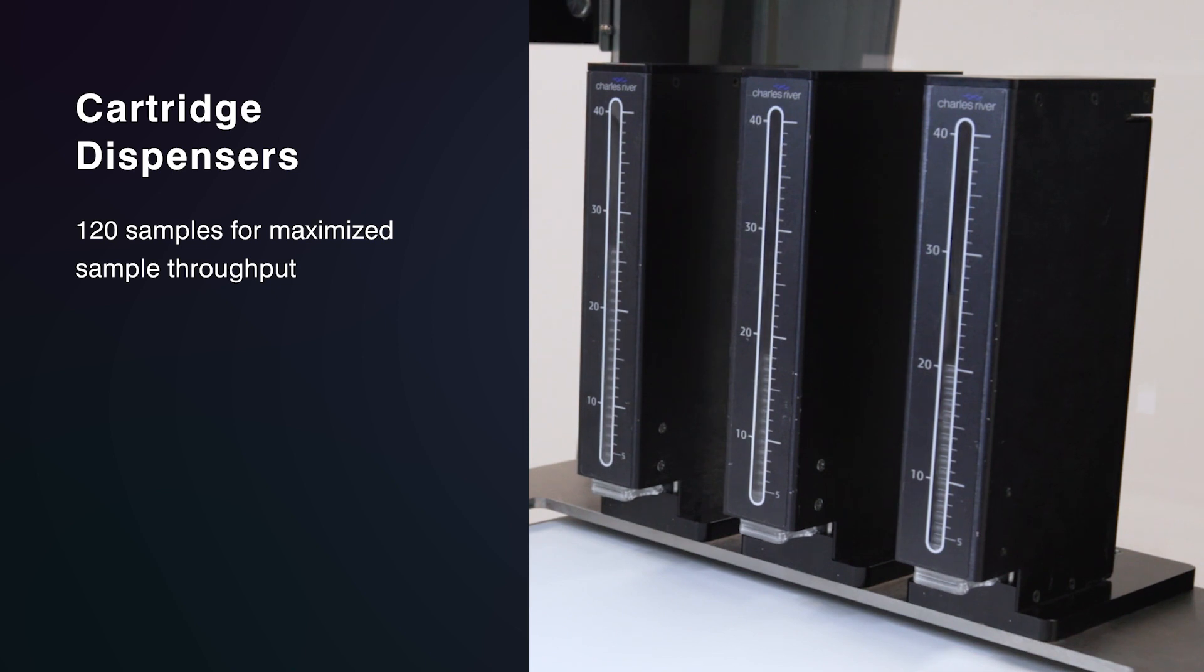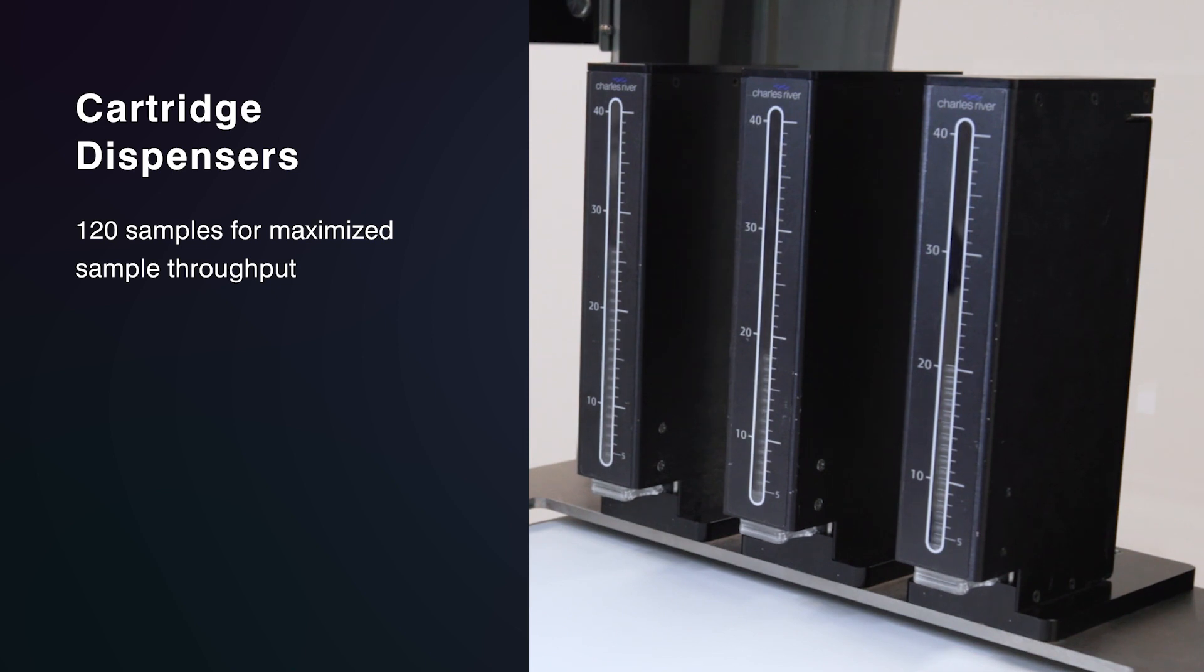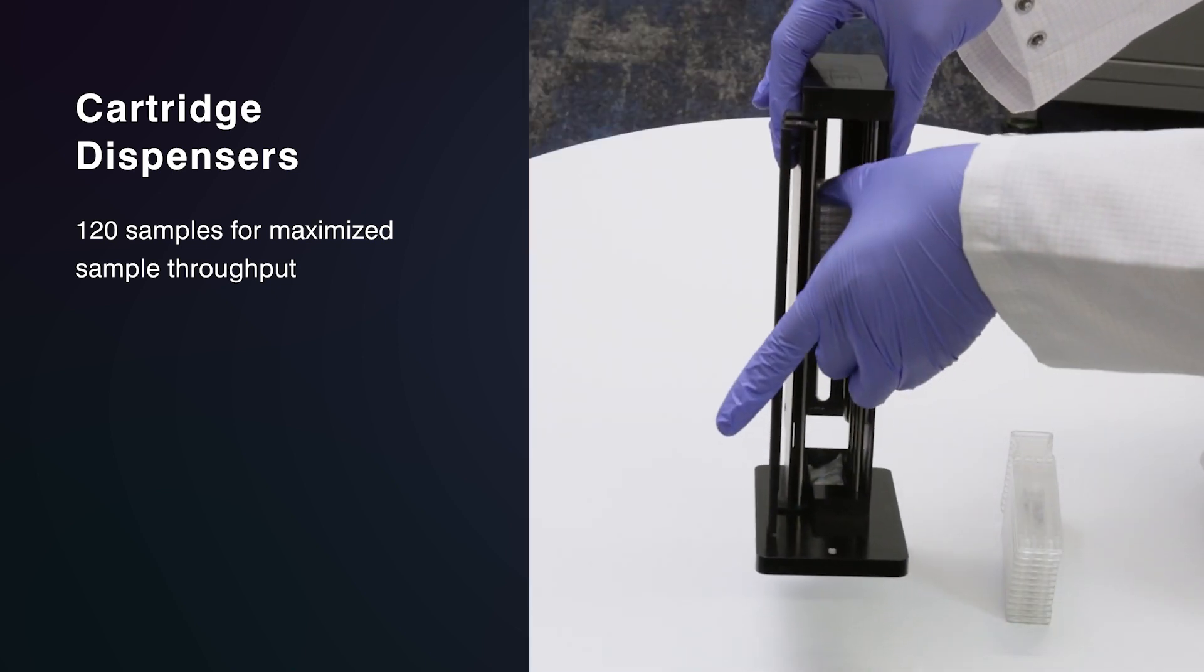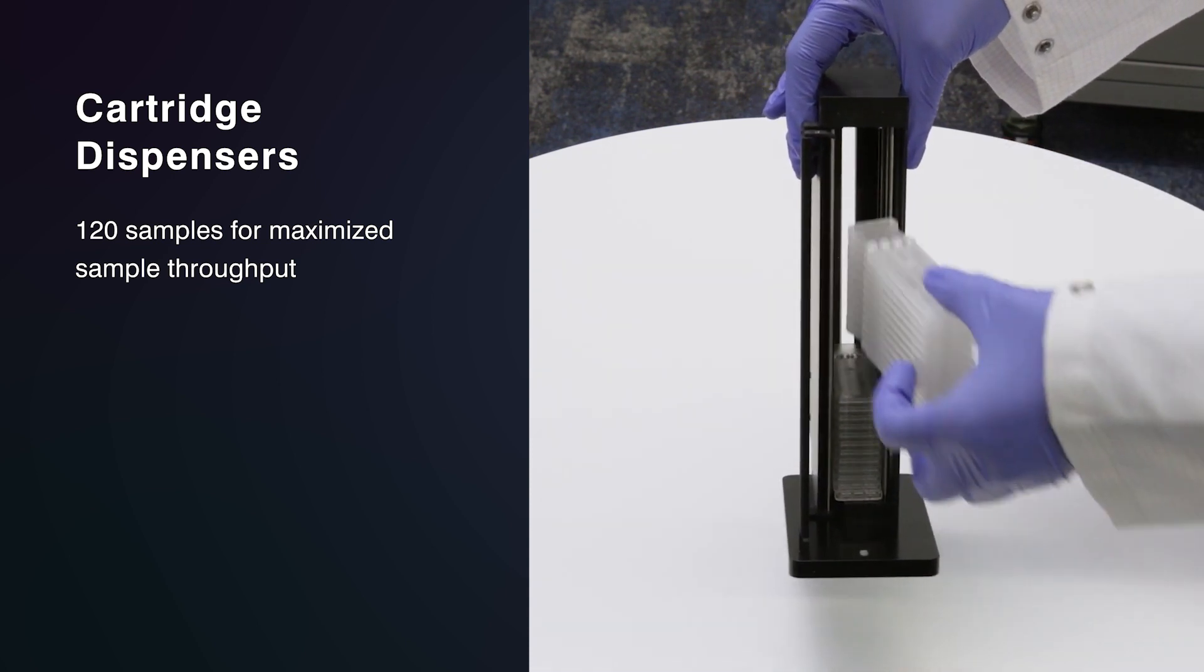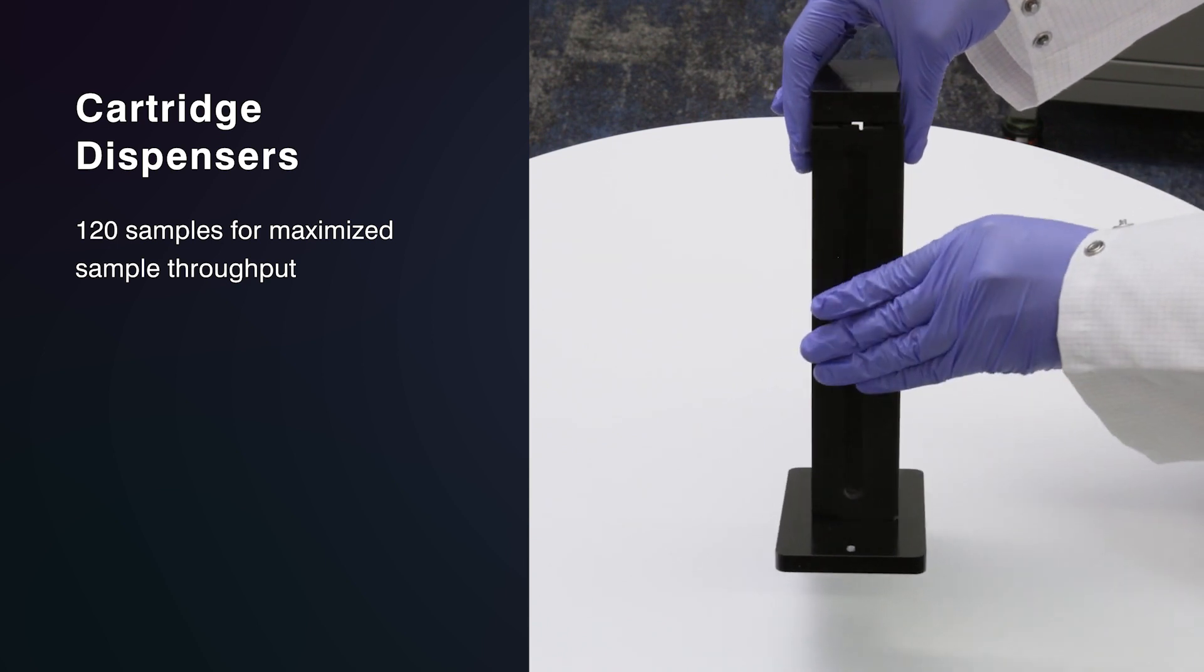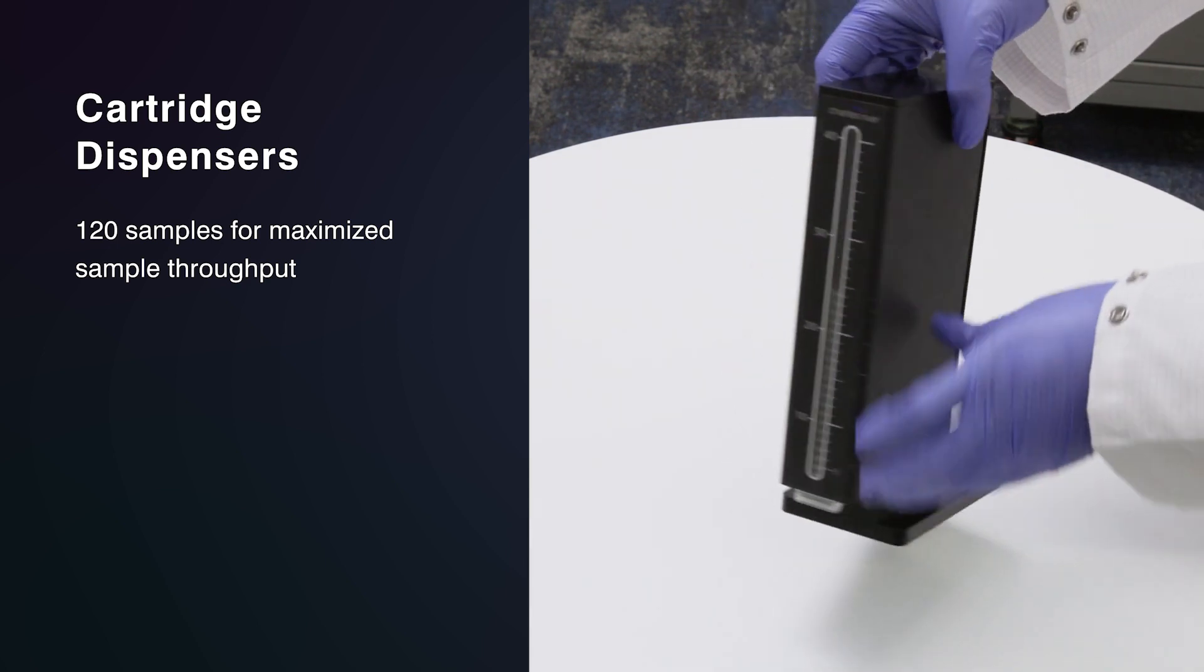There are three cartridge dispensers that hold the EndoSafe cartridges. Each dispenser can be loaded with up to 40 cartridges of the same sensitivity, for a total of up to 120 diluted or undiluted samples per run, allowing for maximized sample throughput.